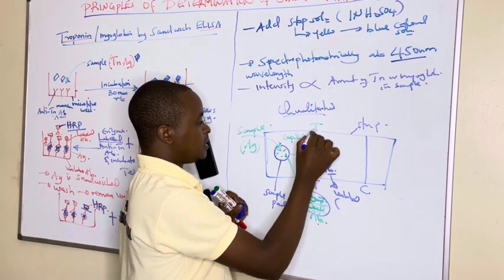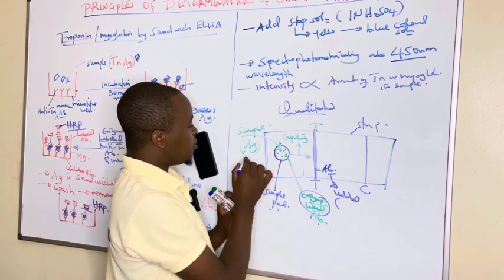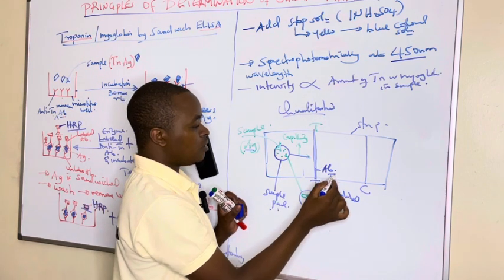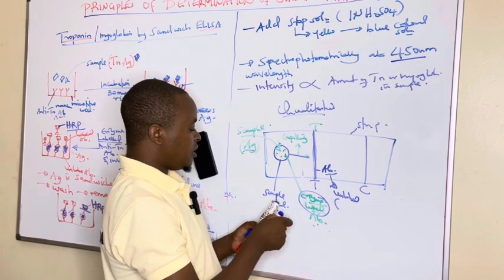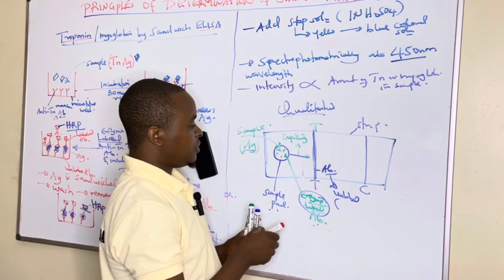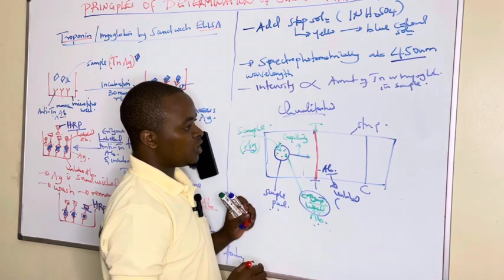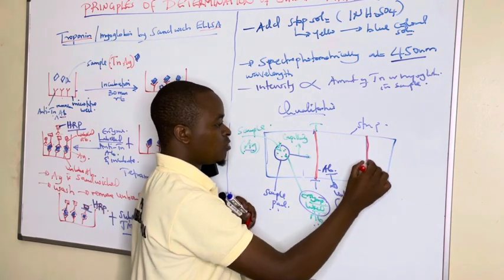So whenever the sample containing the antigen with the enzyme linked antibody moves by capillarity towards the test area and finds the unlabeled antibody, they are captured, and this leads to formation of the pink color. The pink to red color is formed showing positive. Then it continues moving and also reacts with the control area.